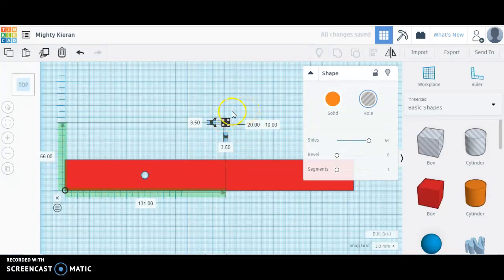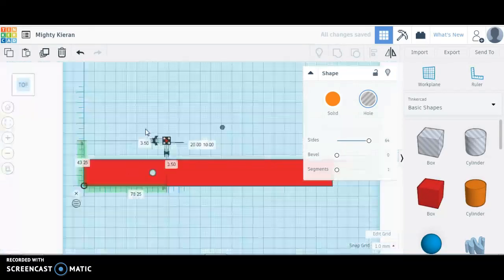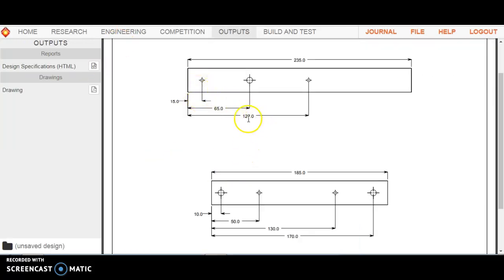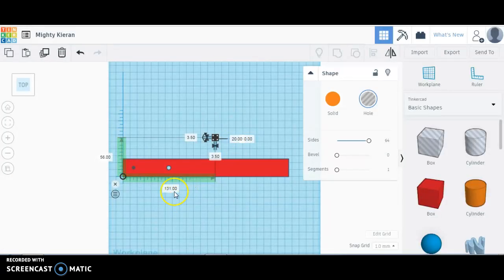Okay, with that selected, I could use my Control C, Control V, copy paste to make an additional hole that I know I'm going to need later. Okay, now let's position one of these at 15 millimeters and 12.5. And this one will be at, so here's the 15 right in the middle. This one is at 127 and right in the middle. Of course, your dimensions are going to vary depending a lot on your design. I'm just building this off of the default. So for here, 127 millimeters and 12.5.